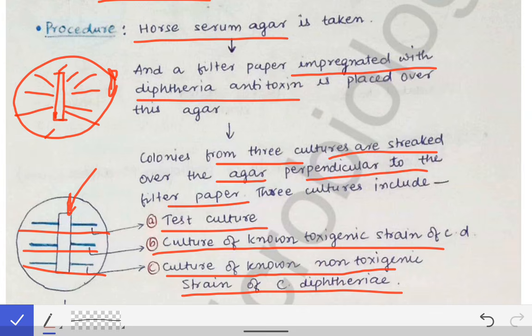So what is the need of putting these two? I can understand that the test culture is streaked for knowing the toxigenicity of that bacteria. But what is the need of the toxigenic strain and the non-toxigenic strain? This is because the known toxigenic strain is called the positive control. This is to validate the test. If there is no precipitation line with this also, that means the test is invalid.